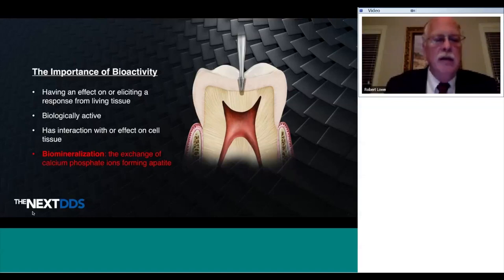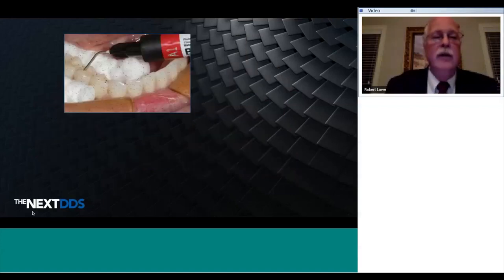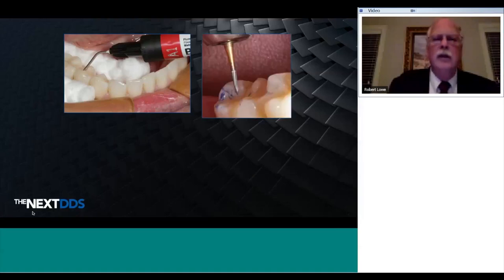So biomineralization today, in my mind, is much more than fluoride release. It involves the exchange of calcium and phosphate ions to help form or reform apatite, the building block of tooth. Restoring the fissurotomy preparations that you saw previously with a composite material, this is a Giomer. A Giomer restorative has a glass filler that is coated with glass ionomer and several other ions. And these ions are released to the microenvironment, which produce a basic effect or basic pH, helping to neutralize acids from bacterial attack. So it's a smart material.